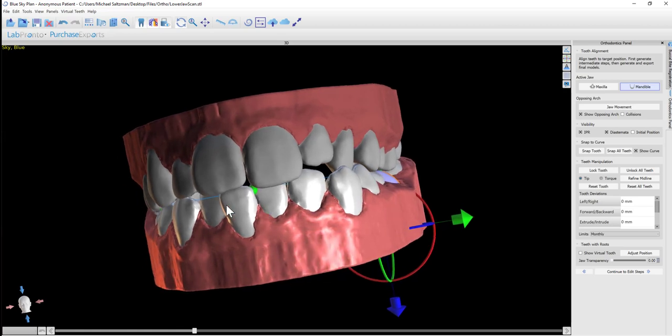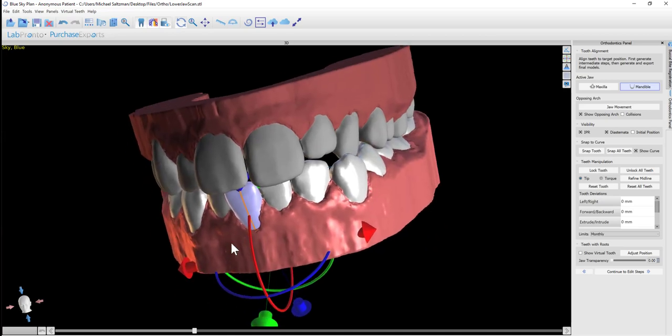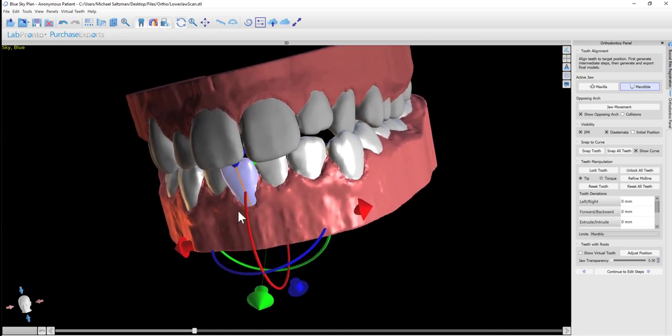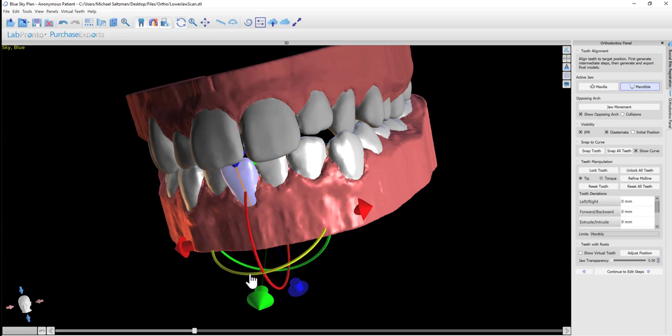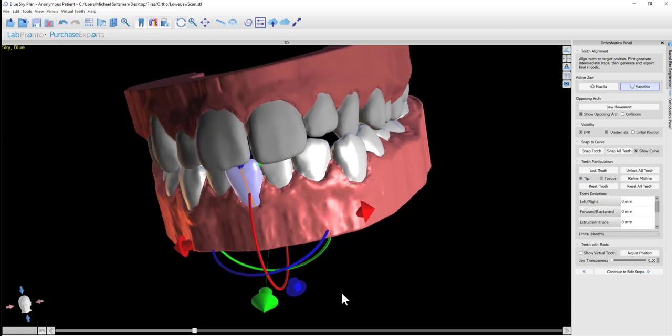If you want to move a particular tooth, you can click on the relevant tooth and the widget becomes active. The widget allows you to pivot the tooth, turn the tooth, and move it in any direction.